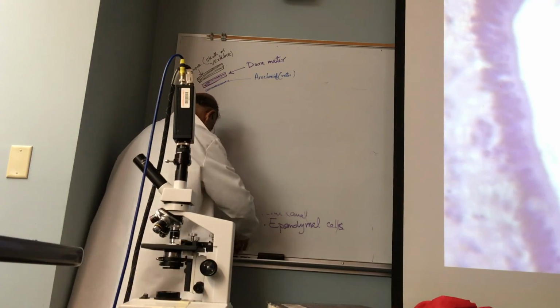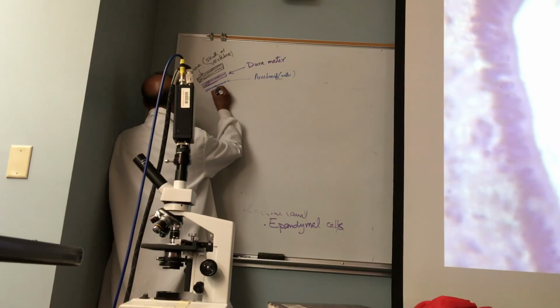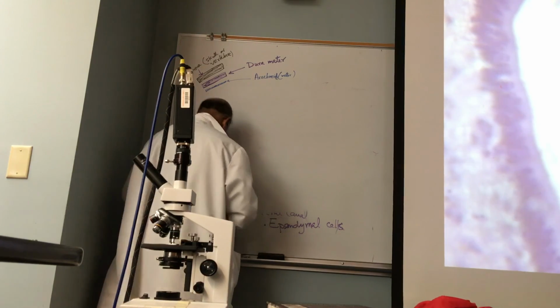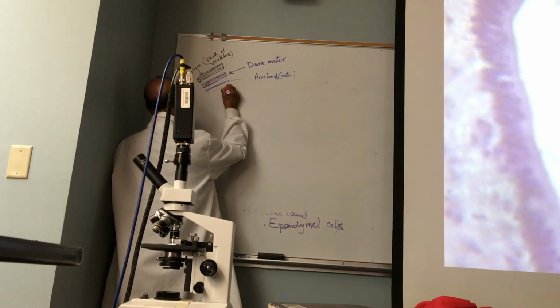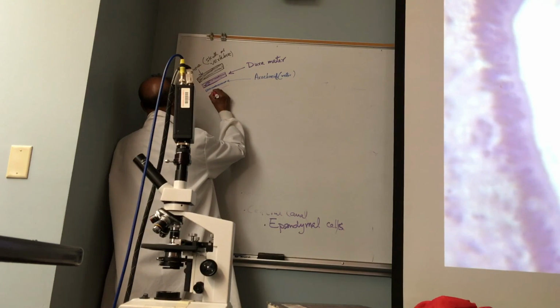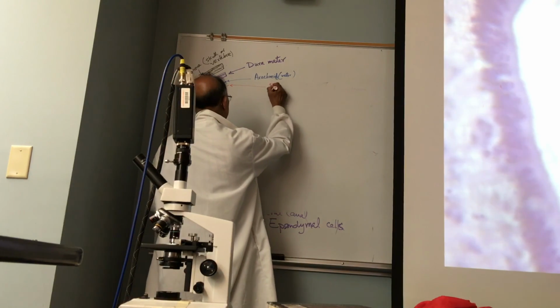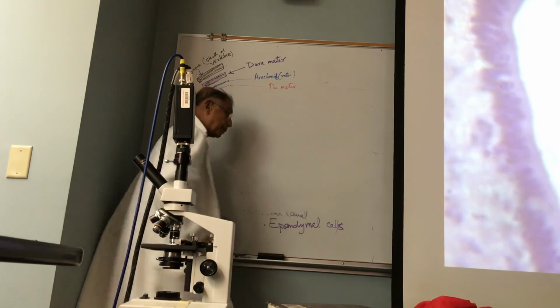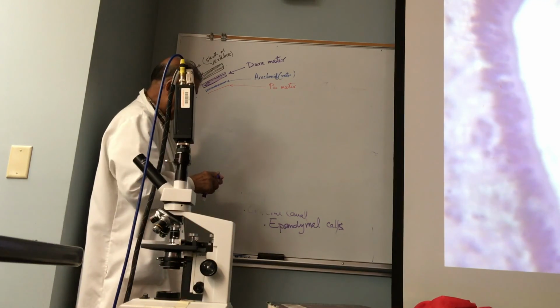Lastly, here, the thin, highly vascularized, meaning richly supplied with blood vessels. This is called the pia mater. Okay?